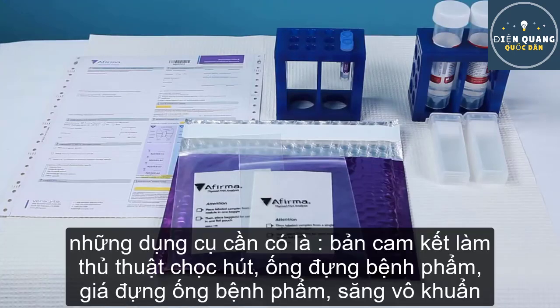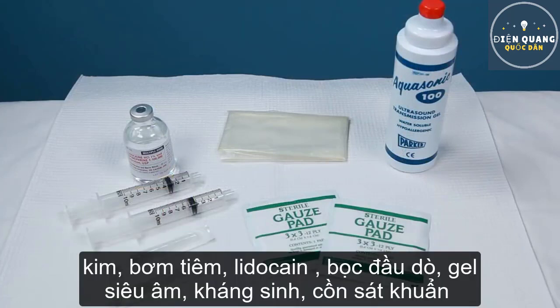You'll need the following items: Afirma Requisition Form, Cytolite Solution Tubes or Slide Holders for Cytopathology, FNA Protect Collection Tubes for the Gene Expression Classifier, Nodule Baggies, and Patient Specific Foil Pouches. You will also need Needles and Syringes, Ultrasound Probe Cover, Ultrasound Gel, Antiseptic Solution, and Alcohol Swabs.